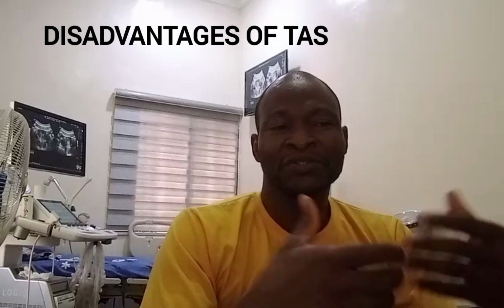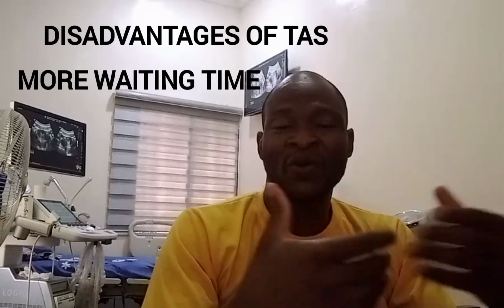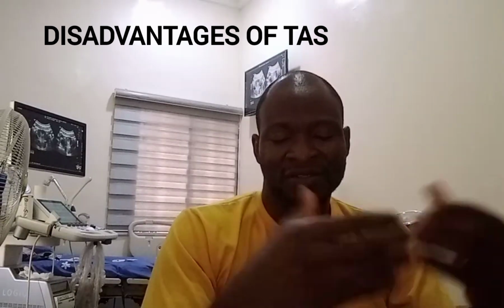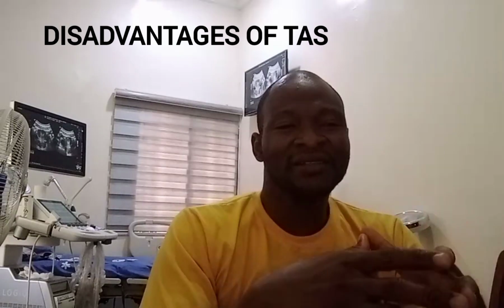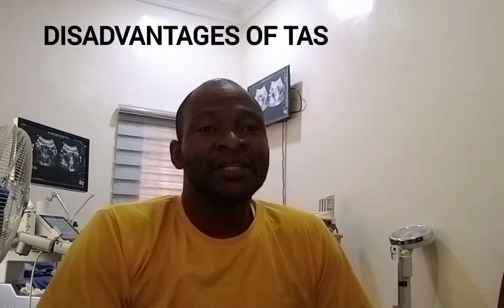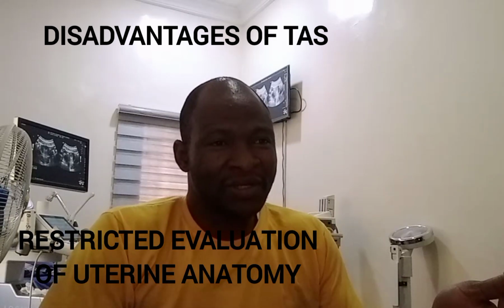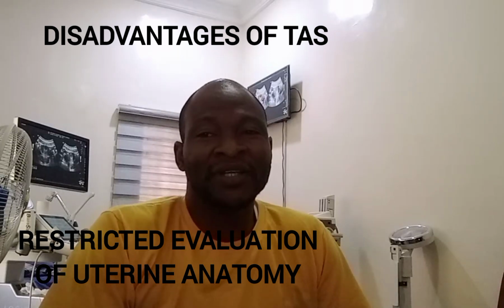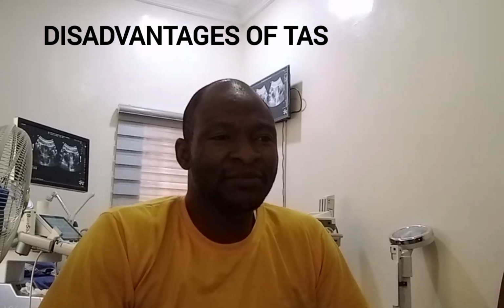for the patient to fill, and may cause pain during the examination, or leakage, and sometimes you want to apply some pressure. So some patients cannot adequately fill their bladder, and you could have difficulty evaluating a retroverted or retroflexed uterus on transabdominal.